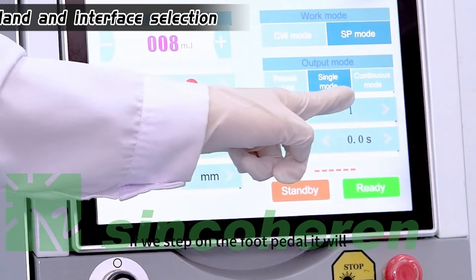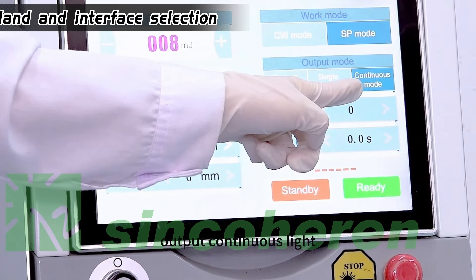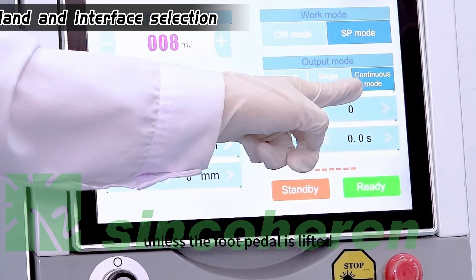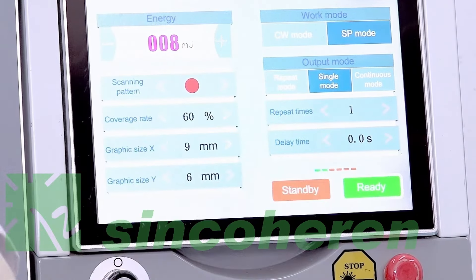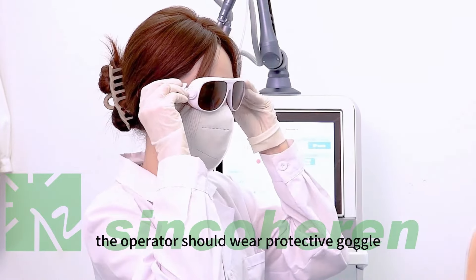In continuous mode, stepping on the foot pedal outputs continuous light until the foot pedal is lifted. We then begin the treatment. The operator should wear protective goggles.